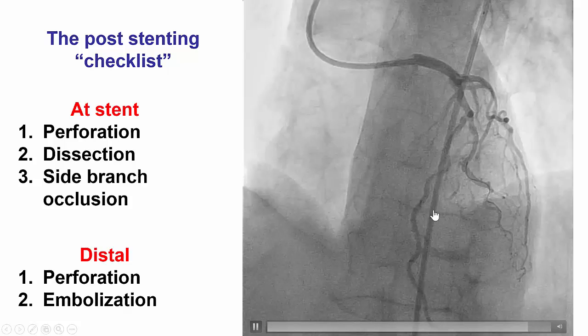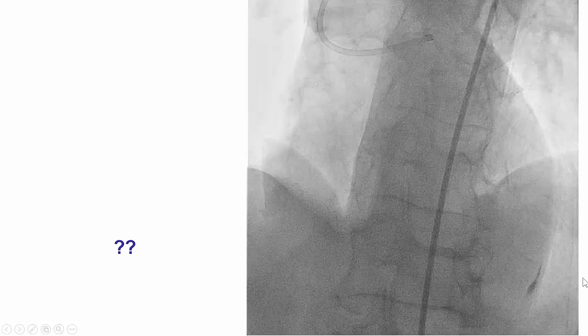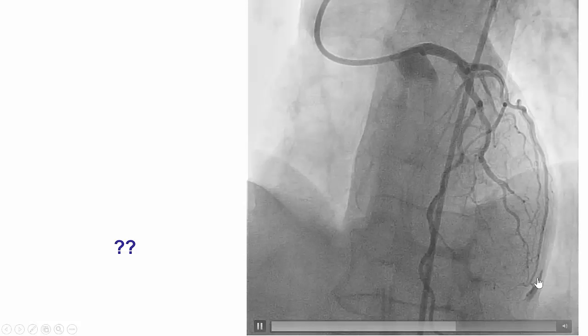At the site of the stent, we make sure there is no perforation — which there is not — and no dissection at the proximal or distal edge, and that the side branches are all there. But we also want to look distally for perforation or distal embolization. Looking more carefully distally, there is some staining, and that staining is highly suggestive of a distal coronary perforation.